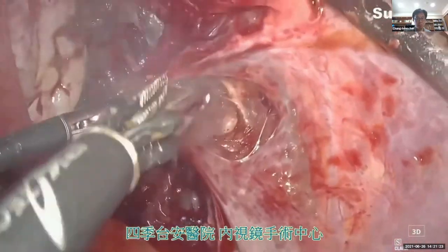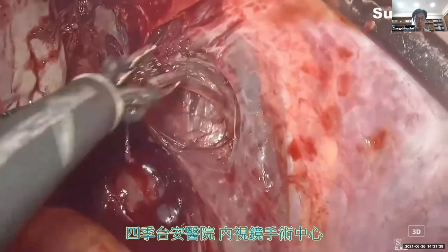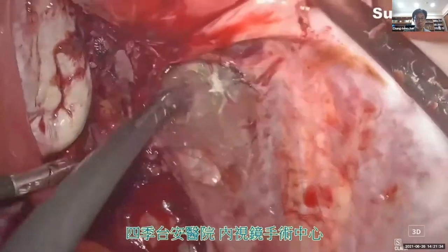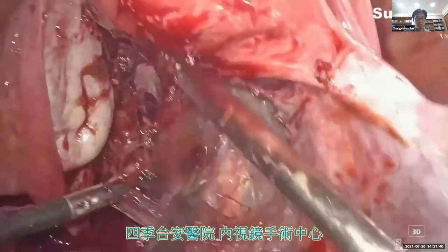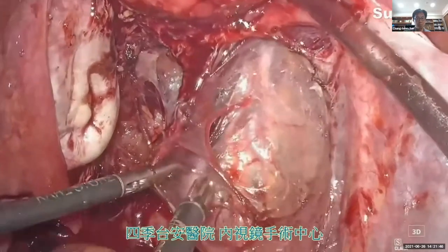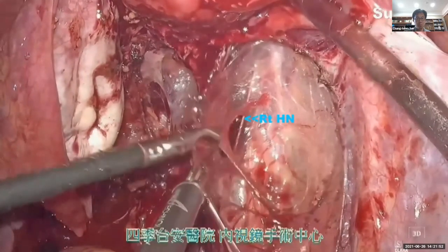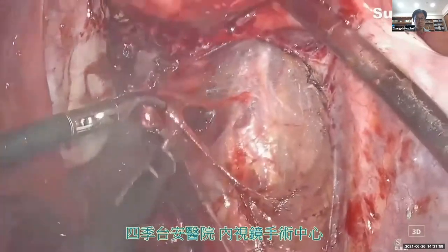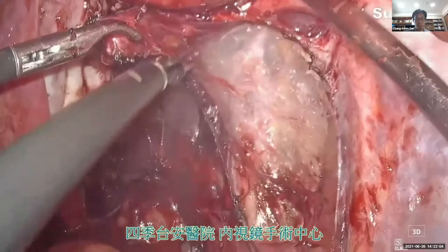Now we enter the right retroperitoneal space in order to isolate the uterosacral ligament and remove the endometriosis lesions over the right ovarian fossa and right uterosacral ligament. You can see the right ureter is here. And if you look very carefully, you can also see the right hypogastric nerve. Now we are removing the endometriosis lesions over the right uterosacral ligament.